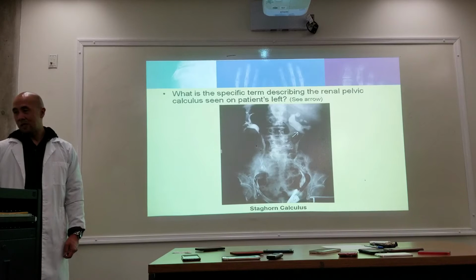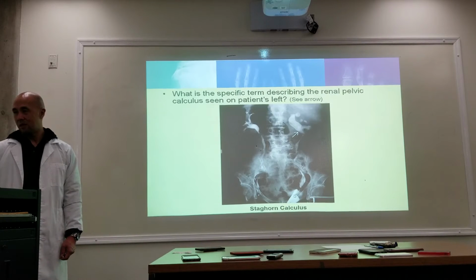See this also? This is also retrograde. Can you see this catheter right here? Okay, so they put that in the bladder and the urethra and they shot contrast. It's retrograde. It's a catheter right there.